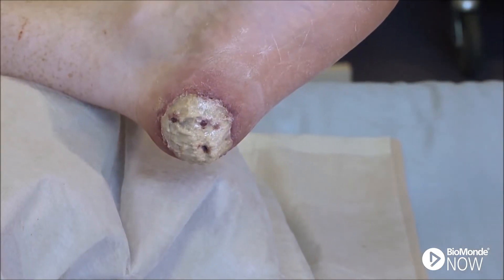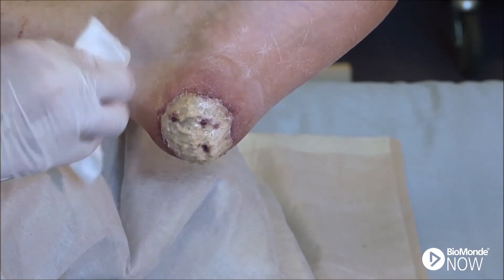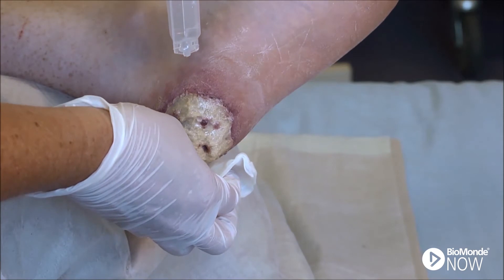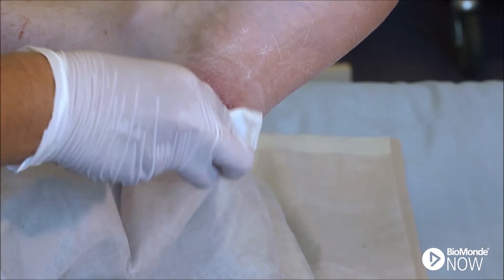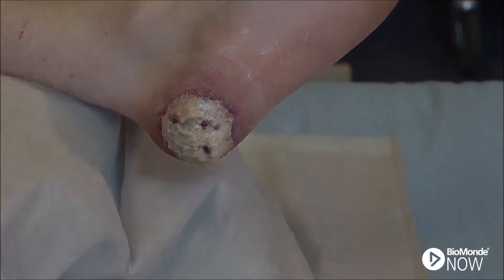Firstly, clean the wound using a gauze pad and irrigate with saline solution. Thoroughly cleansing the wound aims to remove debris and any residue of previous dressings or treatments. This process supports the effectiveness and viability of the larvae.